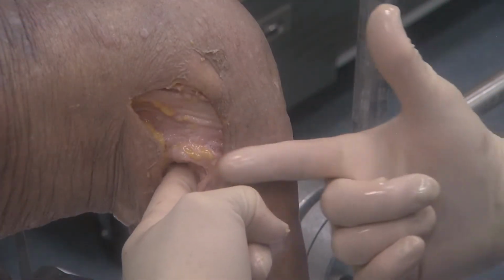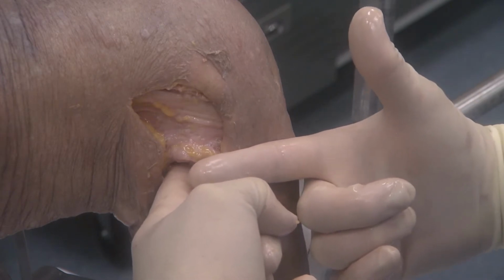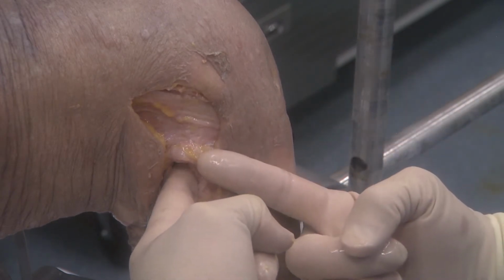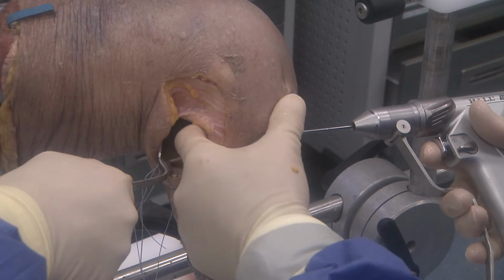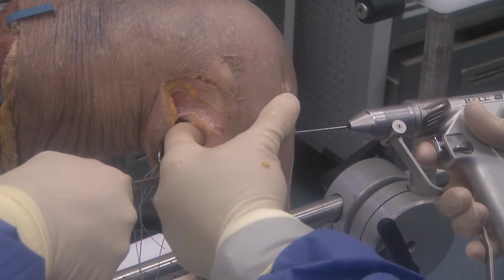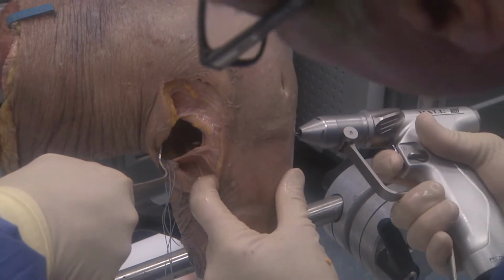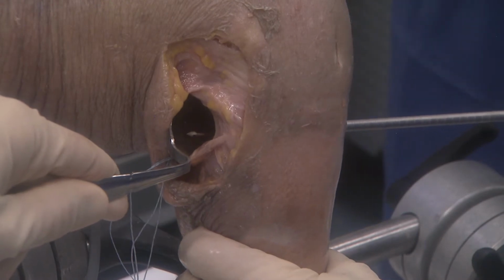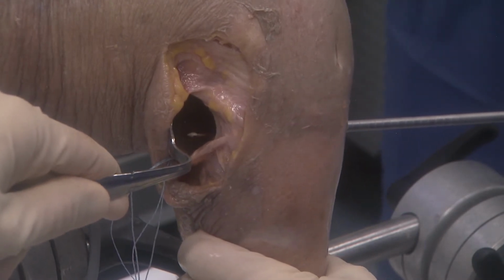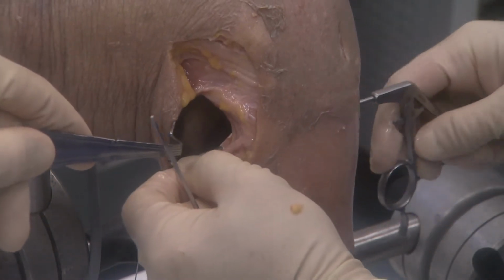If I stay relatively horizontal with my posterolateral corner reconstruction in my tibial tunnel, I will not interfere with my more oblique tunnels for my ACL and PCL. I remove my finger when I'm about ready to go through the cortex, and then I put my finger back in after I've gone through the cortex to make sure I'm in the right position. I've hit exactly where I want to be. So you can see that guide pin. So we're going to ream with an 8 millimeter reamer, relatively close to the joint surface, about 2 centimeters away. Now we want to place a passing suture that we'll later use to pull the graft.